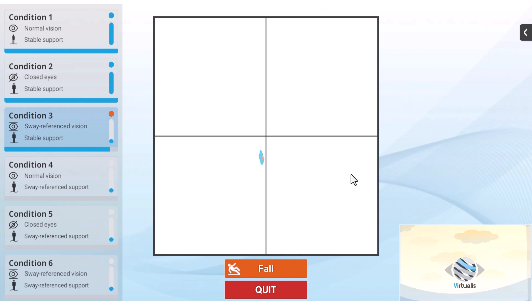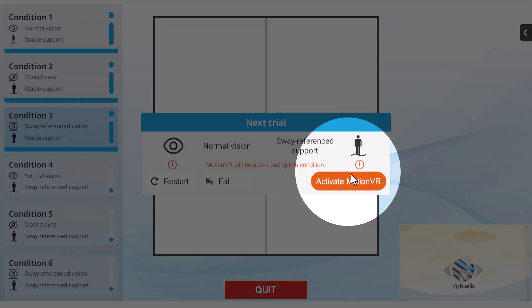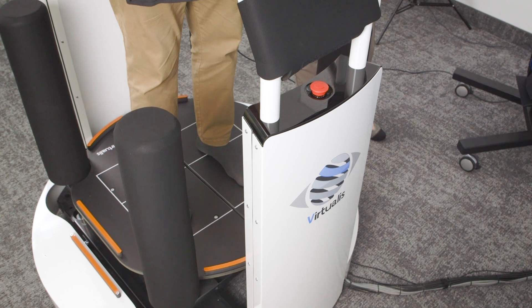After completing condition three, you will need to activate the dynamic force plate in the software. Instruct the patient to move their feet side to side so they can adapt — the surface is now unstable.